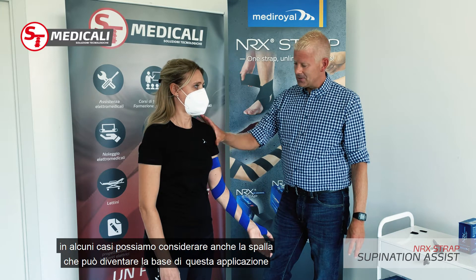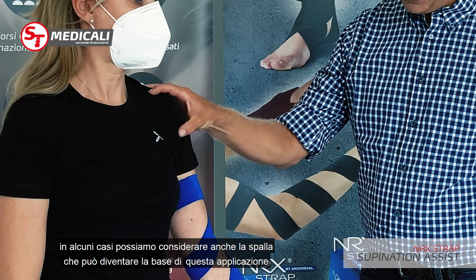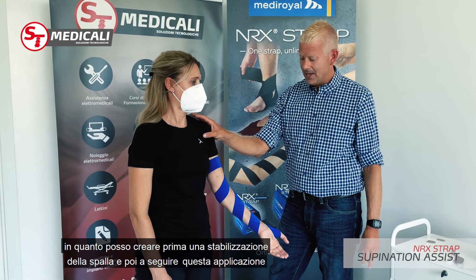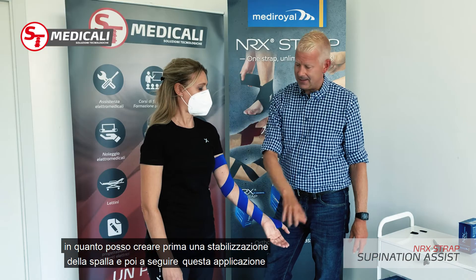In some cases I'm also addressing the shoulder, since the shoulder is the base of this application. So if we have an anterior dislocation of the shoulder, I might have to stabilize the shoulder first and then apply this strap.